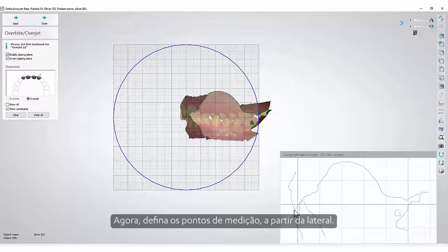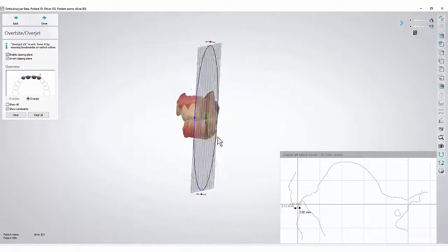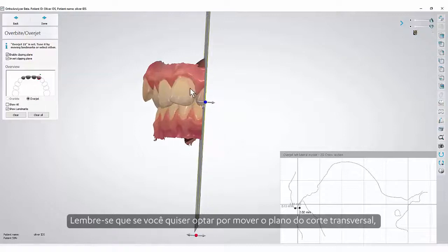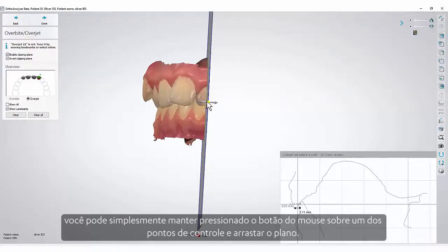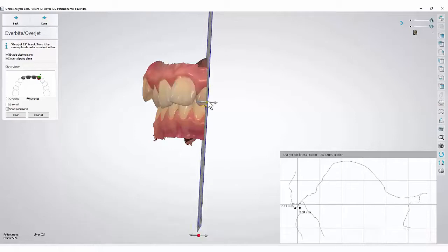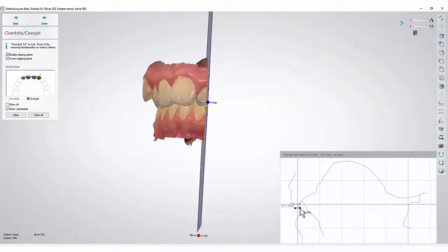Now set the measurement points, starting from the lateral. Remember that if you wish to move the cross-section plane, you can simply hold the mouse button on one of the control points and drag the plane. The measurement points will follow it as well.